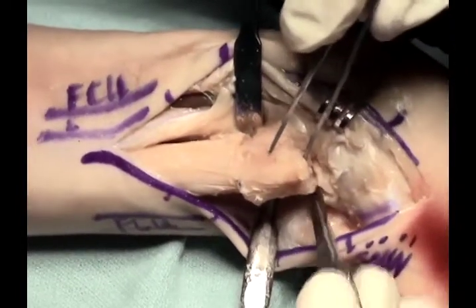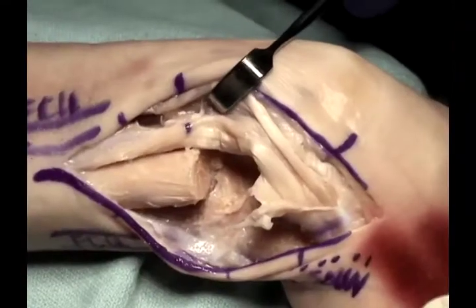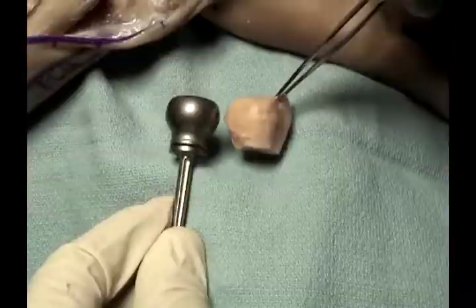The distal ulna segment is then sharply excised, taking care to protect the neurovascular structures. The existing head can then be used as a way to measure for the implant size.